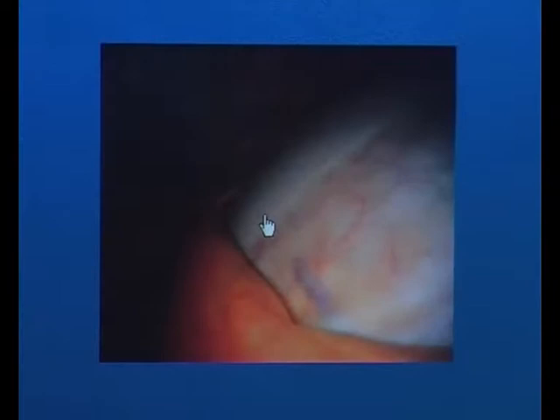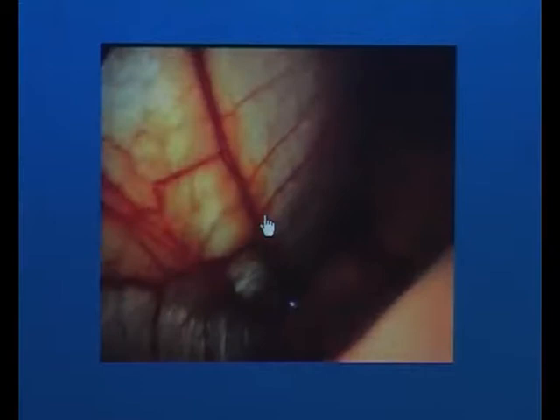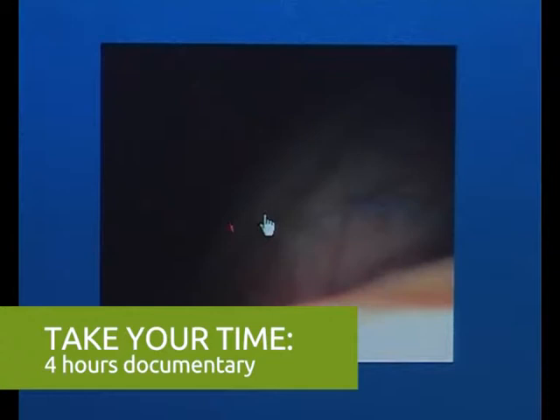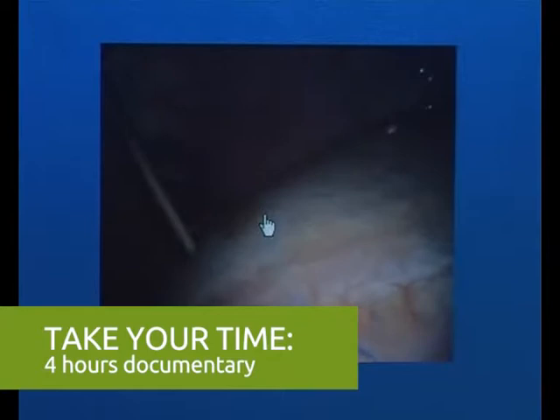Okay, this is another case of abomasal displacement. We see the not displaced abomasum, but a strongly dilated abomasum, not gas-filled, but strongly fluid-filled. And if the abomasum is strongly fluid-filled, it's not necessary to insufflate the abomasum. It's no problem to fix the abomasum in this position directly. So you can go in. And we go back.